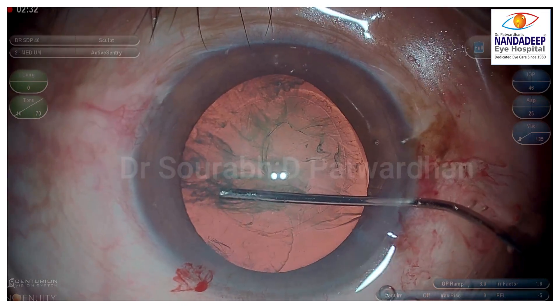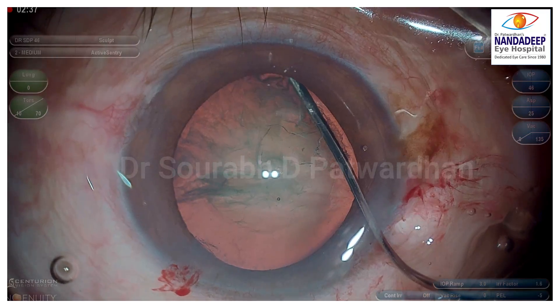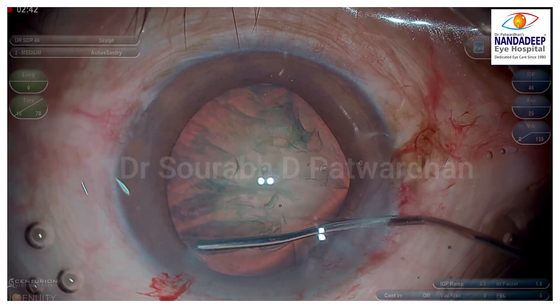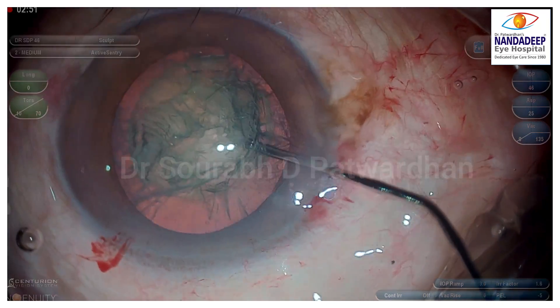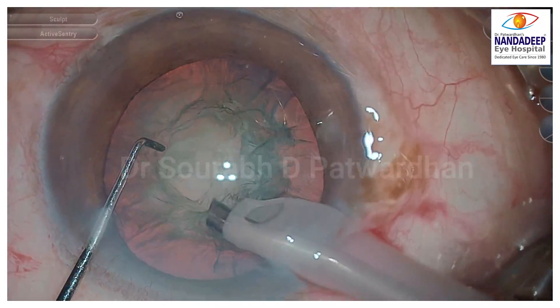And there is the hydro dissection. As shown in my video on the secret of hydro dissection — go to the periphery, and whenever you have that resistance, start pushing more. That's the key to achieving complete hydro dissection. I generally rotate the nucleus with the same cannula, but beginners can do it with a dialer — that's better.